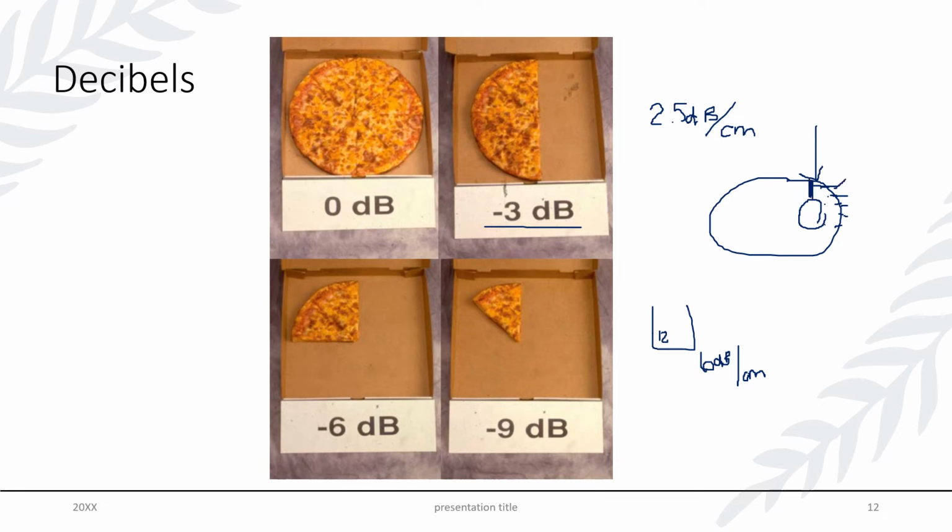But coming over here and scanning through a window of their ribs, I would have to go through half that much tissue. Thus, my attenuation would be better, and I would get a lot more beam to interact with my kidney to improve my visualization.